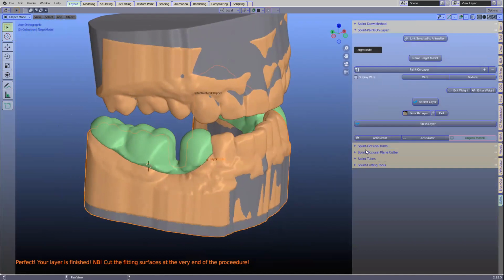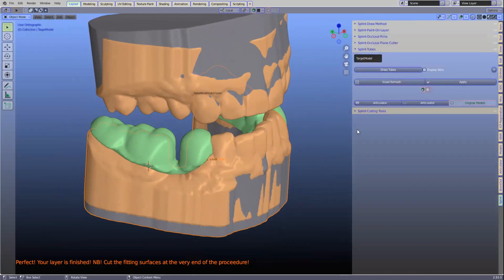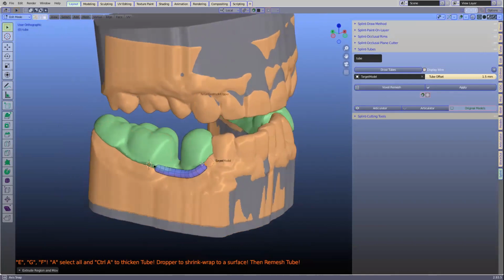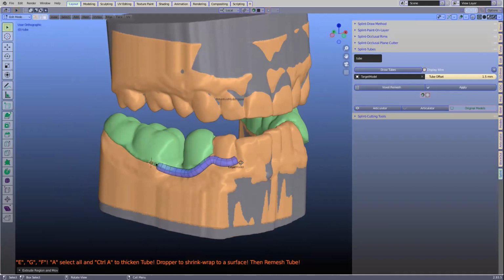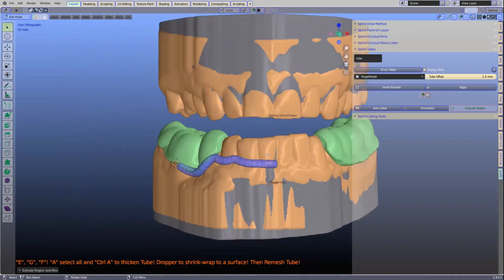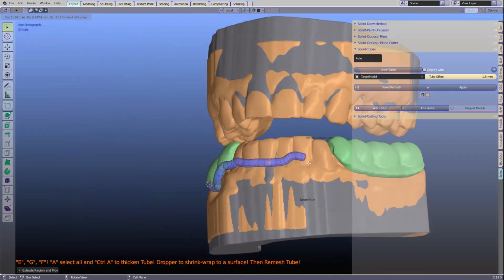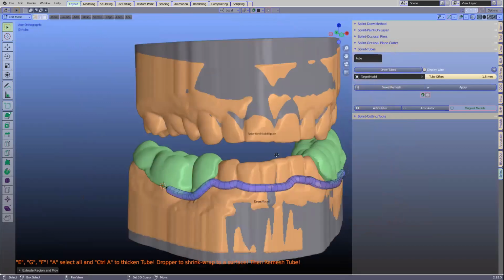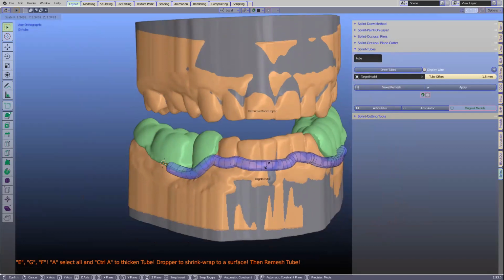So can you elaborate on this tubing? So we started the tube on the molar actually, and there's also good reason for that, because getting these splints in and out of the mouth, it's not always that easy. So imagine the patient's trying to get there with the finger and tuck it under a splint which has got the border fairly flush. We decided, hey, let's just make a tube there that gives the patient some kind of a grip to flick it out of the mouth. And of course, the front tube stops any tooth movement.